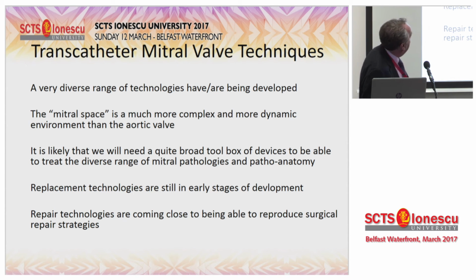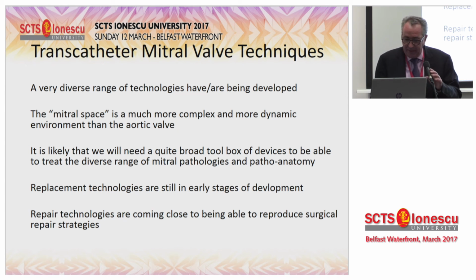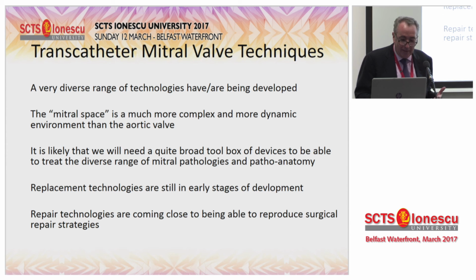So to summarize, there's a very diverse range of technologies that have been or are being developed. The mitral space is a much more complex, more dynamic environment, and it's likely that we will need a number of different devices to deal with these different sizes, different pathologies. The replacement technologies are still in the early stages of development, and I think quite a lot of iteration of those devices will be required before they really come into mainstream practice.